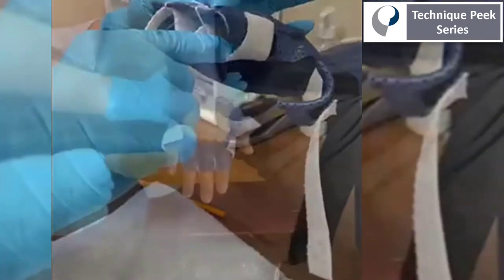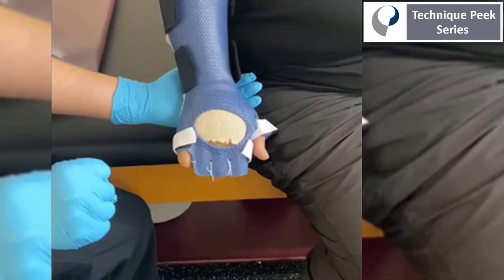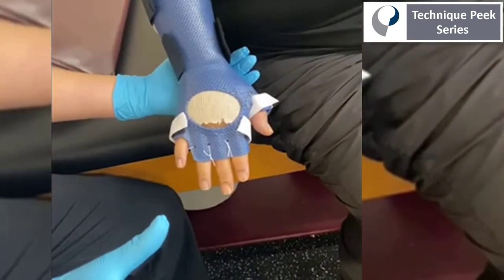Here, you can see the individual troughs we created. And on the patient, you can see active flexion with passive extension provided by the splint material and the elastic strap.